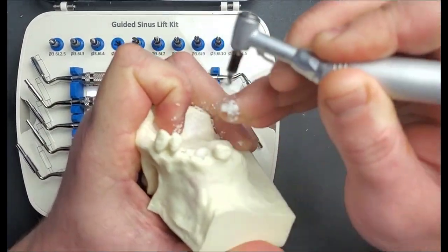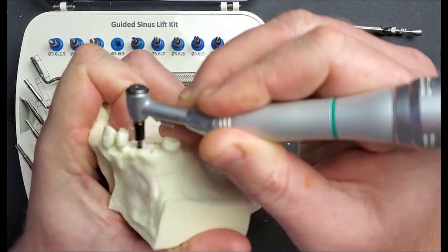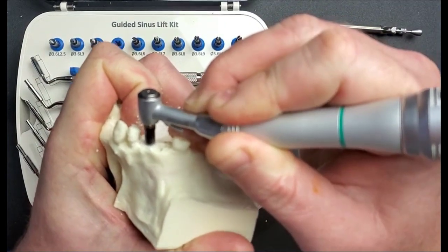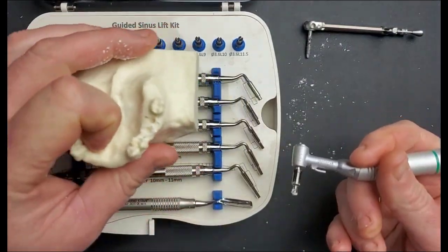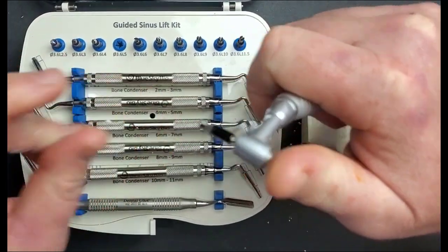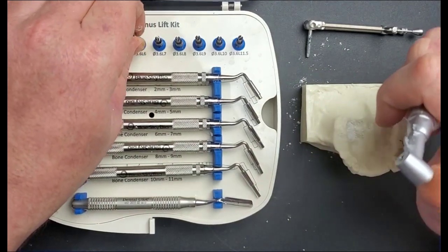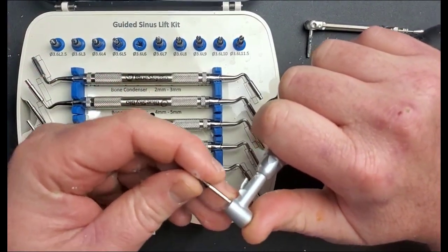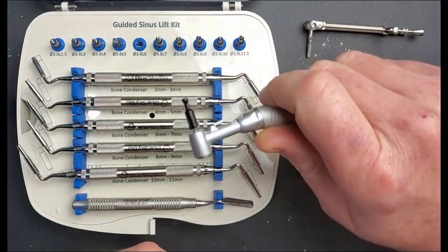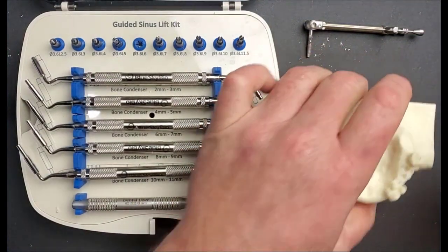We bottom out at five millimeters and then repeat the process on the anterior site. You'll notice that after using that initial profiling drill there's no tendency for the drill to walk at all — that keeps you really centered. Just make sure you nail it with your initial drill and get the positioning you want in the crest. Now we'll go up to the six millimeter drill and since this is roughly the distance I expect to break through, we need to slow down and start checking for when you gain patency through the sinus floor.